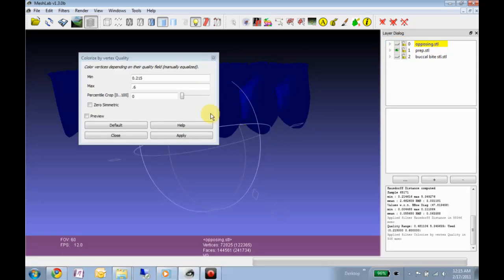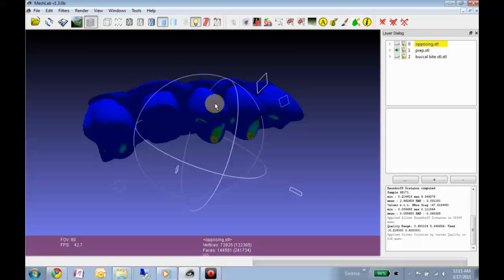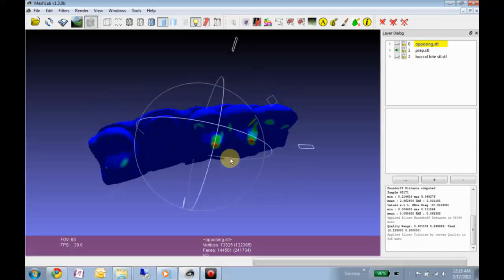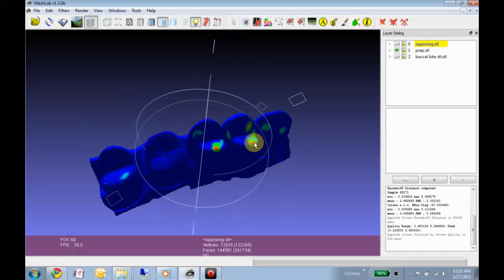Then hide the opposing, and this shows our contacts.